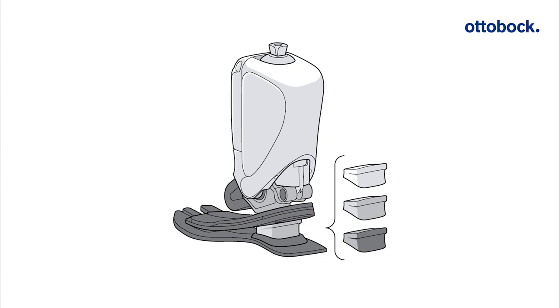Ottobock recommends starting with the pre-installed gray heel wedge. If the user desires a firmer heel strike, please choose the black wedge. For a softer heel strike, please choose the transparent wedge.